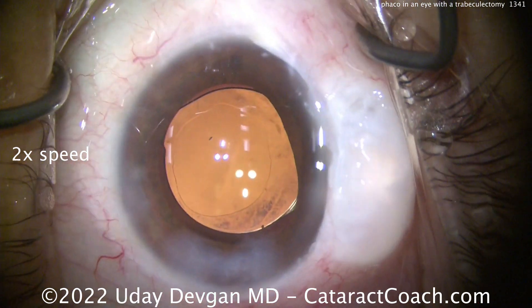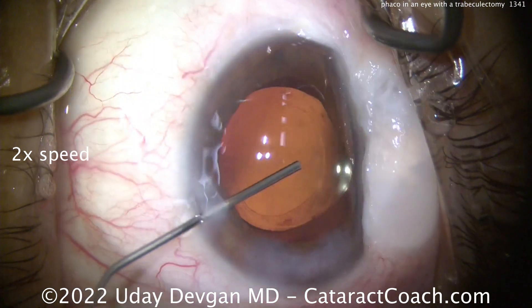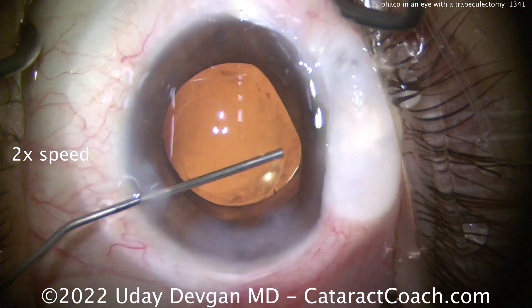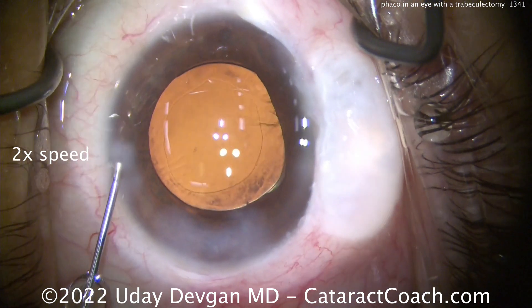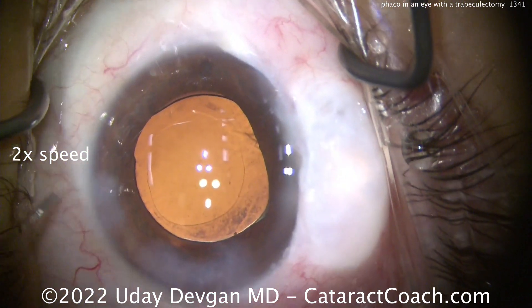Sealing up the incision — nice long tunnel length going in here. I'm going to inject in that area where the trabeculectomy is to make sure there's no retained viscoelastic in that area. And that looks pretty darn good.